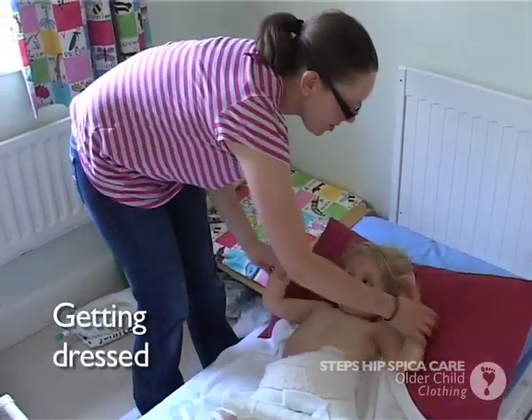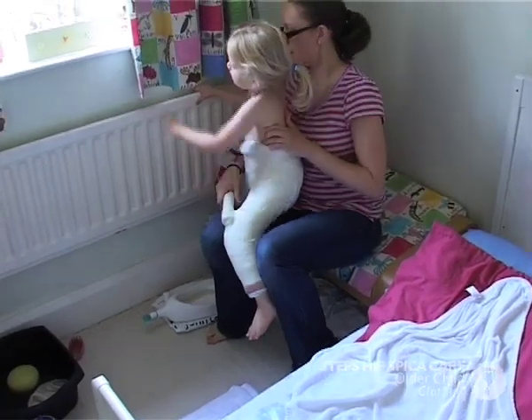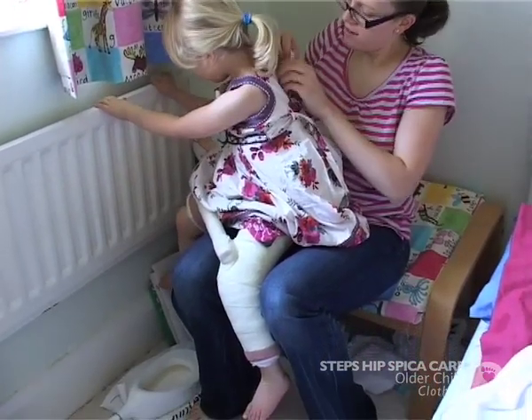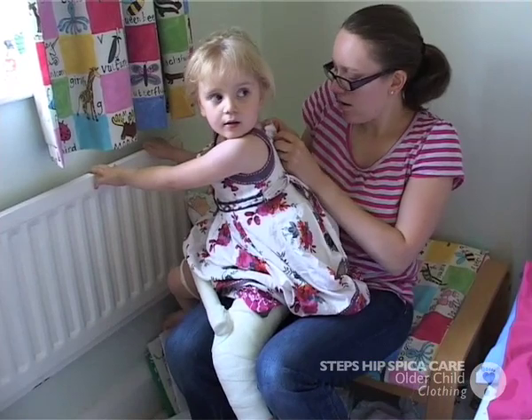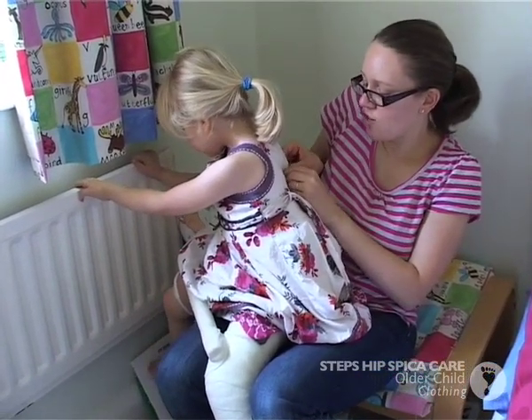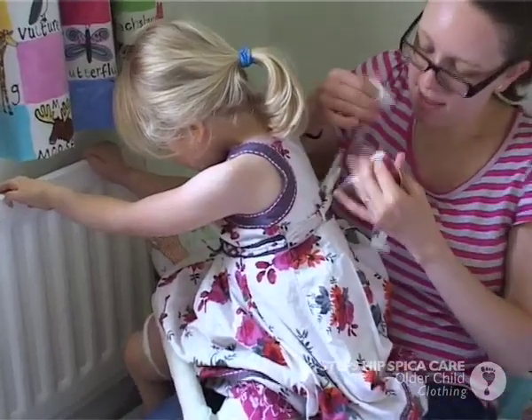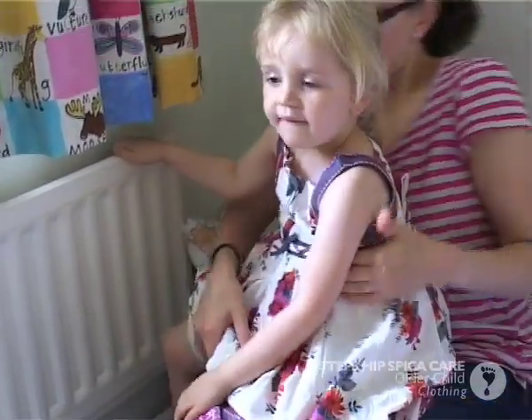The best way to put a pair of pants on with her legs and the bar in between is to take the sides off and put ribbons on, then you tie them on. The way I do it with Bethan is I get her onto my knee and then she helps me by holding onto the radiator. I did try putting her dress on over the top when she was lying down in bed, but it was such a difficult manoeuvre and all her dress was getting rucked up at the back. This way seemed to be the easiest, and I get everything ready so I can just go straight downstairs.